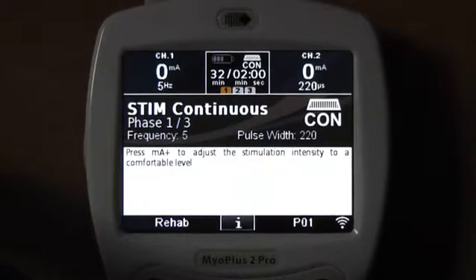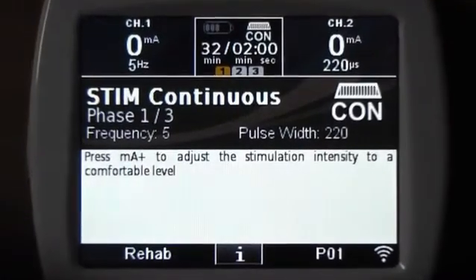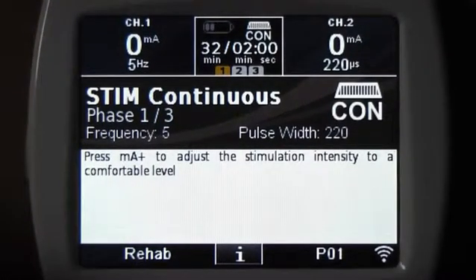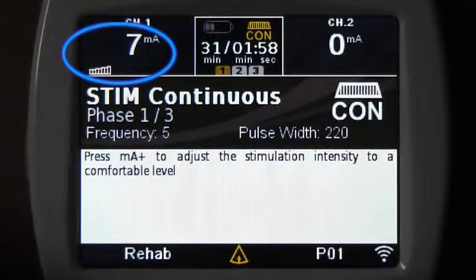Let's see what is on the display if the selected treatment is stimulation. You start the program by pressing the milliamp plus button and you can see the level of stimulation intensity going up. Adjust it to a comfortable level.